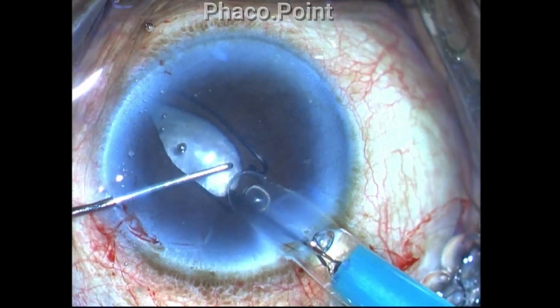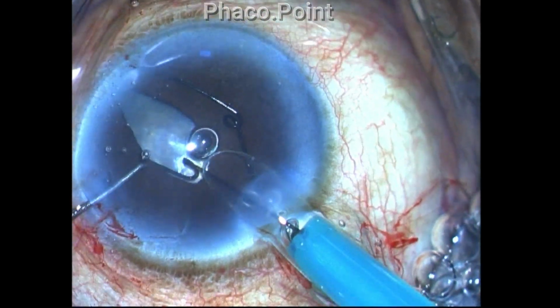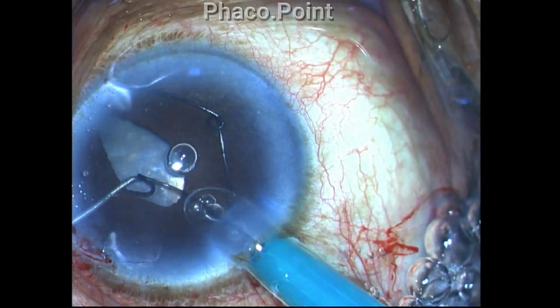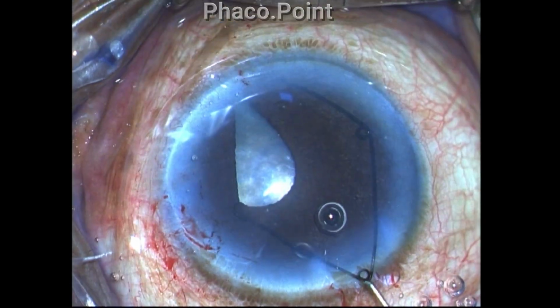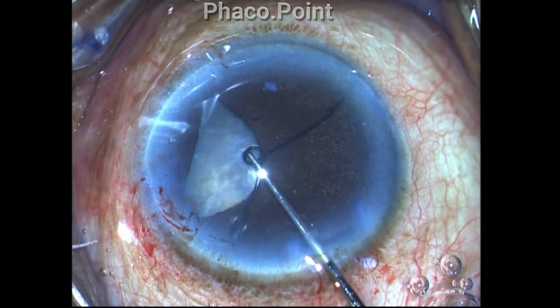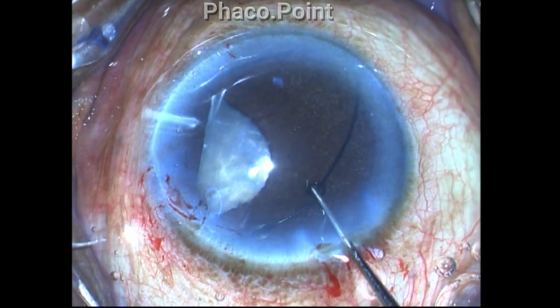But in this case, I did not suspect that the patient could have a sphincter sclerosis. I thought this was just senile miosis, and therefore I went about trying to inject the Gupta ring, which I use. And only when I am trying to engage the loops of the pupil dilating device, I find that this pupil is very small and it is refusing to stretch.